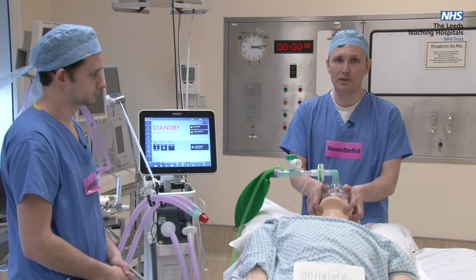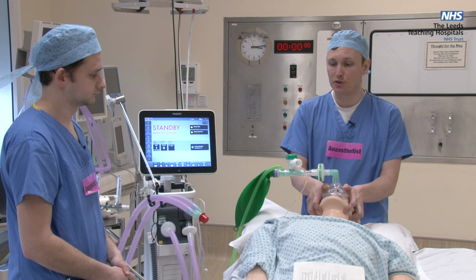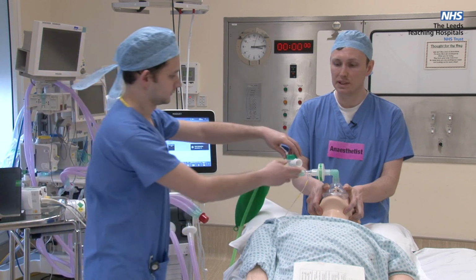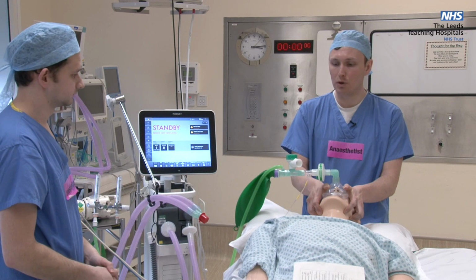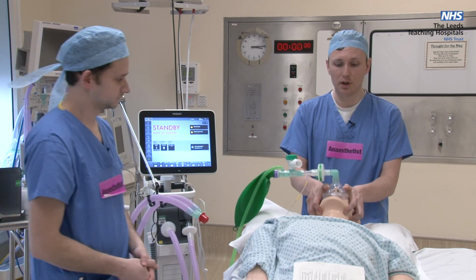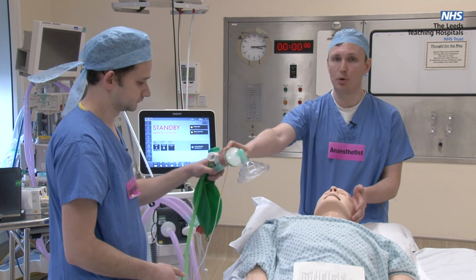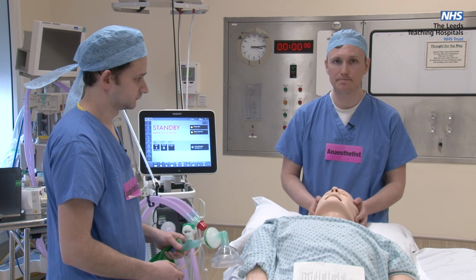Once the drugs have been given, the patient's paralysed, removing it likewise, I'm going to ask Paul to do some things. So first of all, can you open the APL valve completely, please? APL valve open. And can you now turn the oxygen flow off? Oxygen flow off. And then once the oxygen flow is off, and only then, I'll remove the Mapleson C circuit, pass it to Paul, and I will now intubate the patient with my anaesthetic assistant.